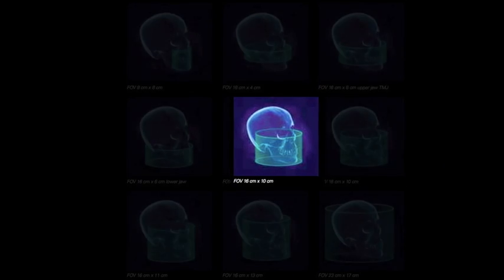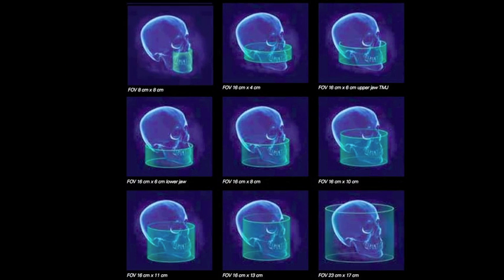Now what's interesting is if we shrink that down to 16 by 10, which can still fit some patients and give us a very exceptional area of interest, which includes the temporomandibular joint and all of the dentition, the exposure is now 39 microsieverts, again considerably lower than where we've been previously. For most of our progress scanning in my office, this would be considered analogous to what we typically use a panoramic X-ray for.